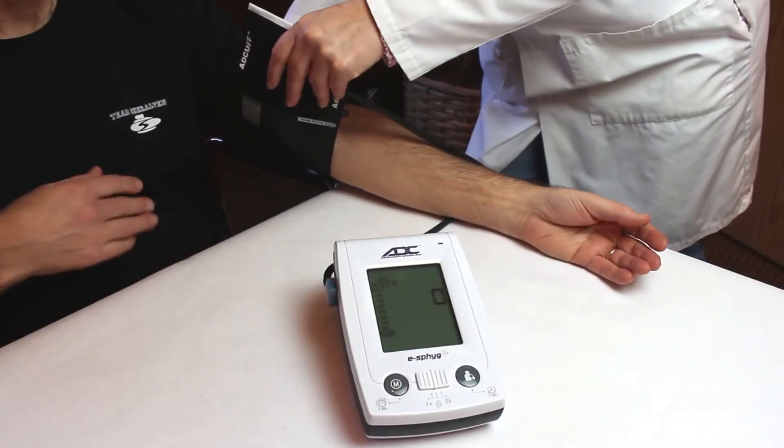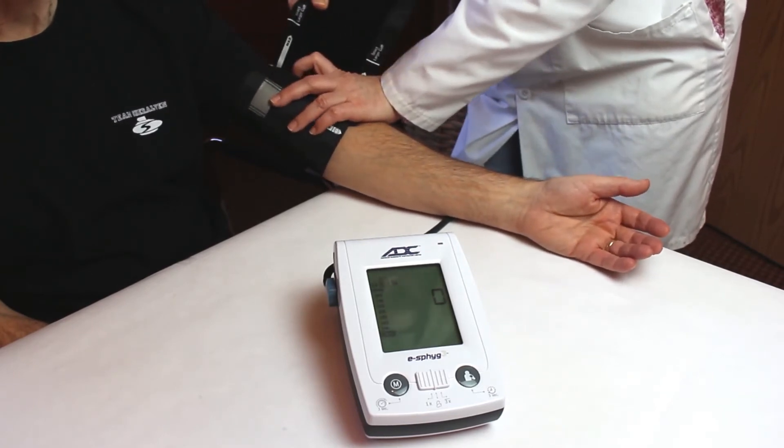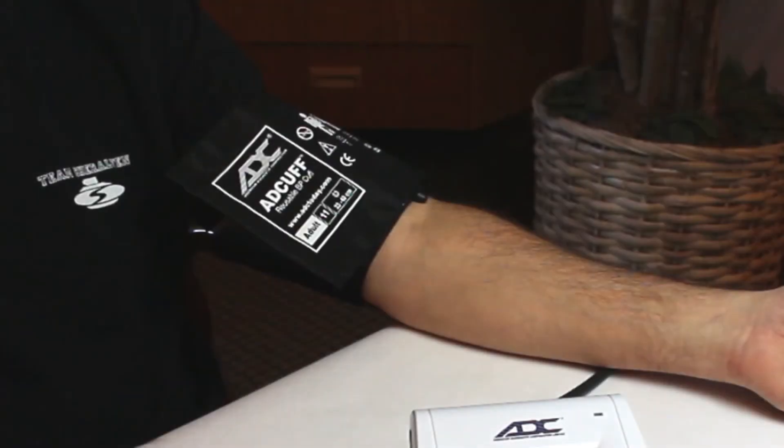Place the cuff around the patient's arm. The cuff index line should fall within the printed range markers. If not, select a larger or smaller cuff to ensure an accurate reading. The artery mark should be positioned over the brachial artery, and the bottom edge of the cuff should be about one inch above the antecubital fold.